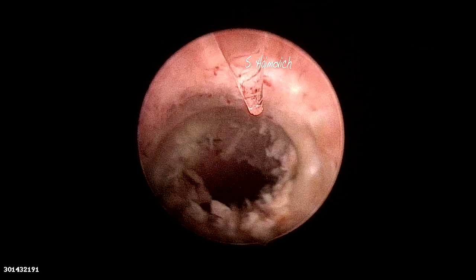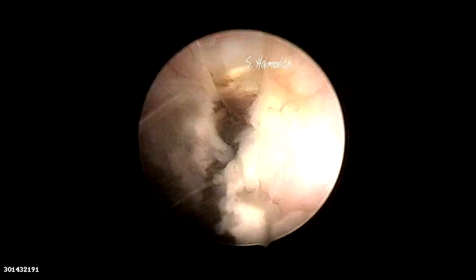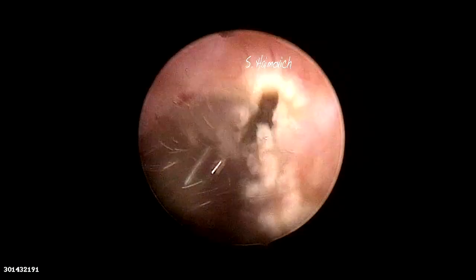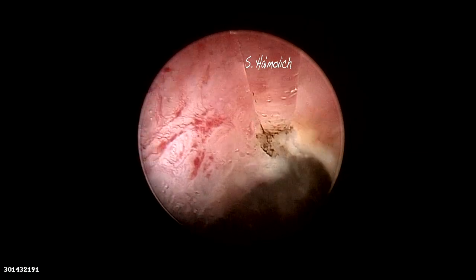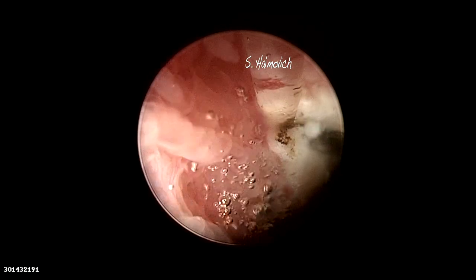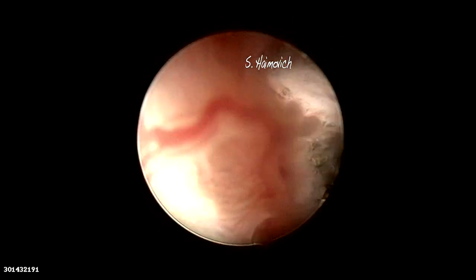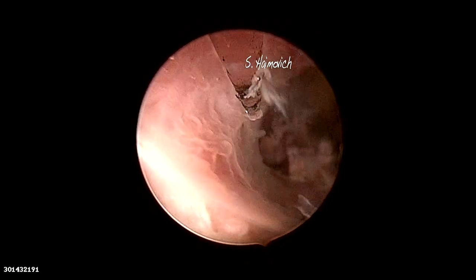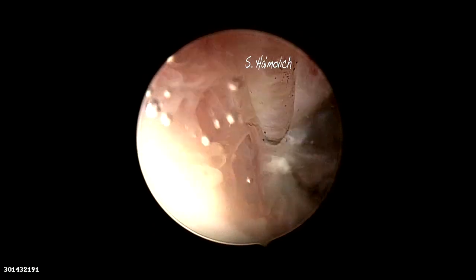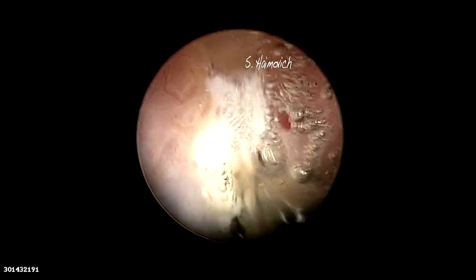With diode laser, we cut and dissect the anterior arc of the isthmocele. The wavelength is 1470 nanometers and has affinity both for water and hemoglobin. It cuts and coagulates simultaneously, with a heat dispersion of 0.5 to 1 millimeter — no deep tissue damage.